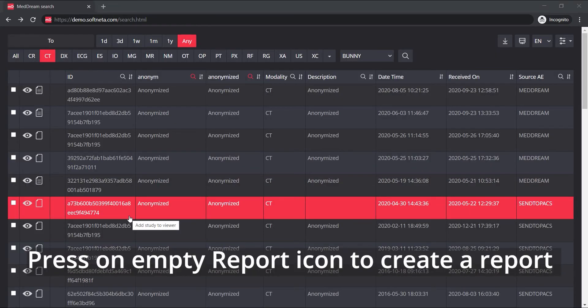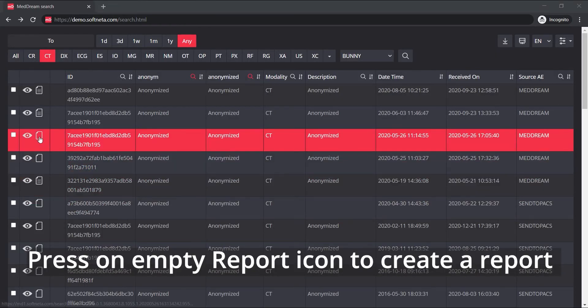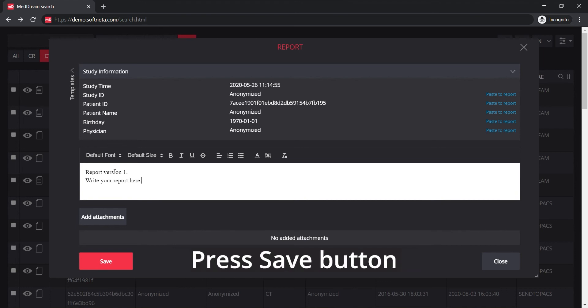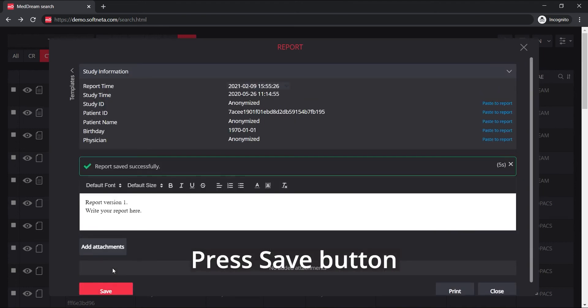Press on the empty report icon to create a report. Fill in the information for the first report, then press the save button to save it.